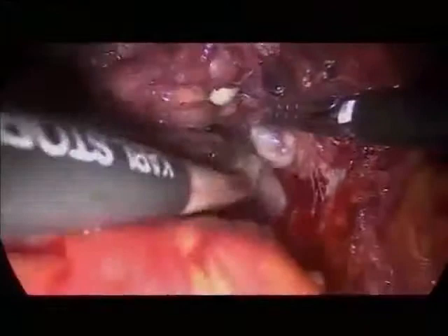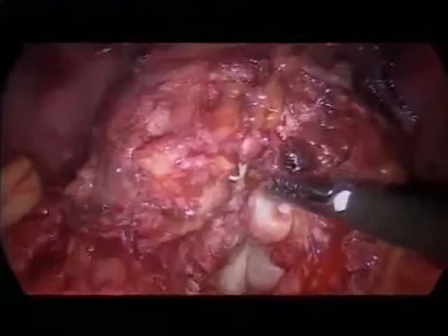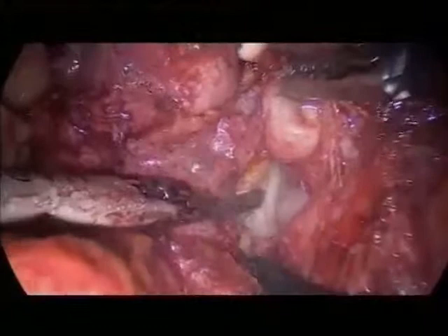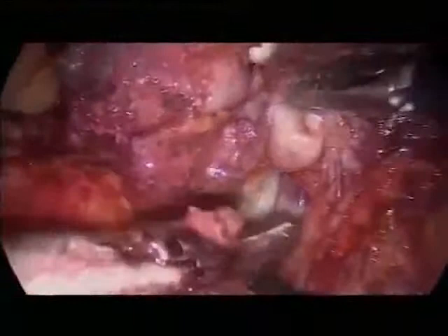Let's say this is a window that we created. So you keep this muscle on the prostate. So you go directly through the tissue around or before the vas, to the vas, so directly to the vas and seminal vesicles. That's right.